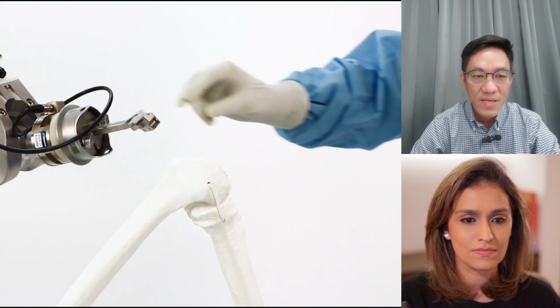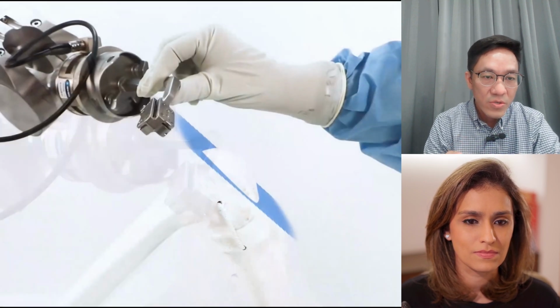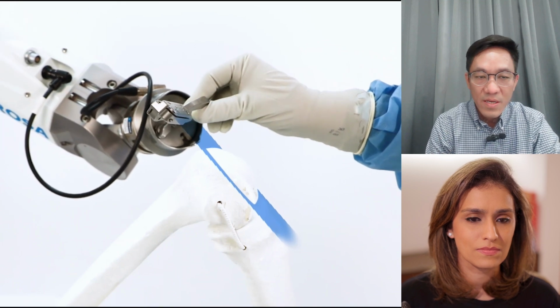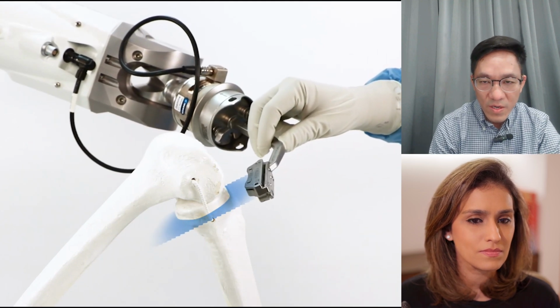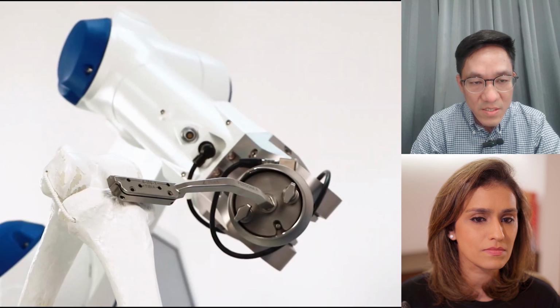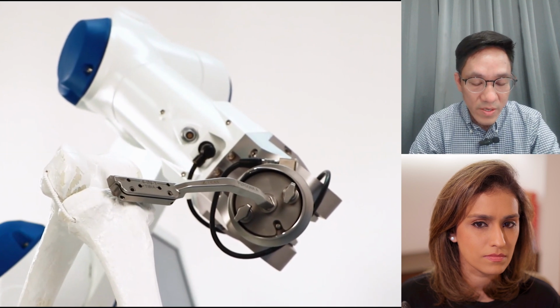Doctor, please tell us a bit on what the surgery would entail, and by this, can you share for the patients that come from Indonesia the travel itinerary they should look into? Oh, okay. In a robotic knee replacement, it is the same process as a conventional knee replacement. However, the surgeon installs robotic tracker arrays that allow the robot to see the patient's knee in real time. The surgery is actually performed with the assistance of the robotic arm, and it is not done by a robot without the surgeon in the operating room.